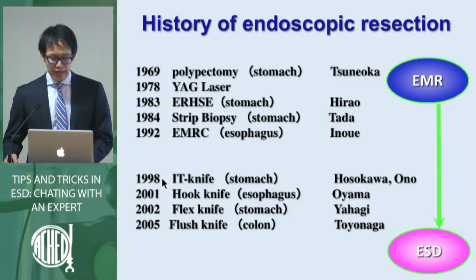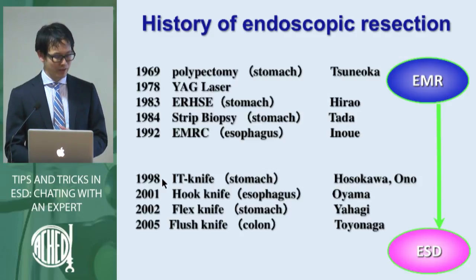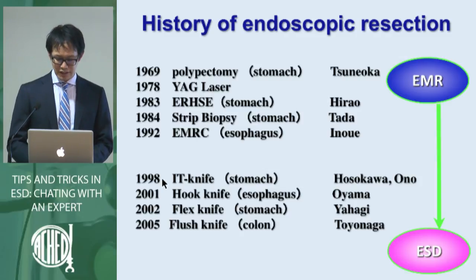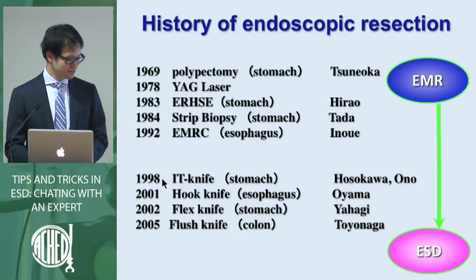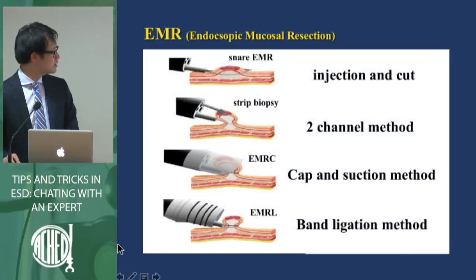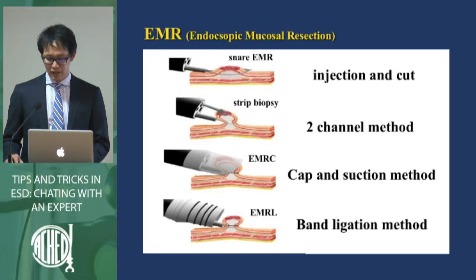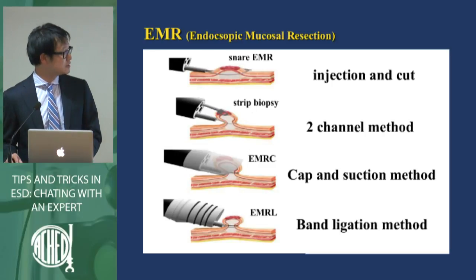So a lot of devices were developed, and now in Japan the time has changed from EMR to ESD. I'd like to show the various EMR methods. We have thought about how to remove large lesions using snares.